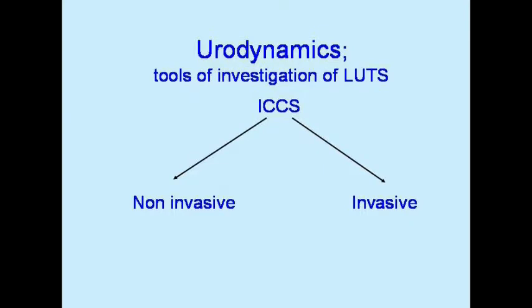Pediatric urodynamics brings to mind reflexly cystometry. However, that is not true, because according to the ICCS definition, urodynamics has a non-invasive along with the invasive component.